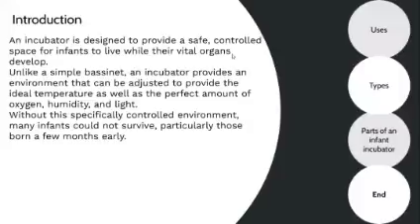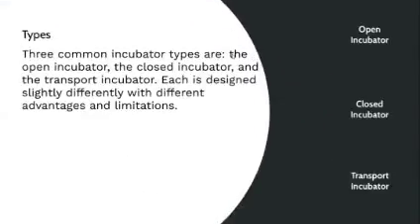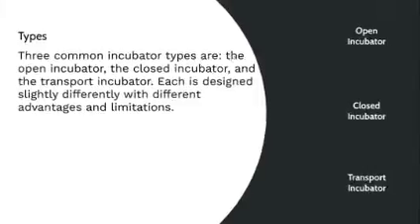Now we will move to types. There are three common incubator types which were discussed in the previous slide: the closed incubator, the transport incubator, and the open incubator. Each one is designed slightly differently with different advantages and limitations.